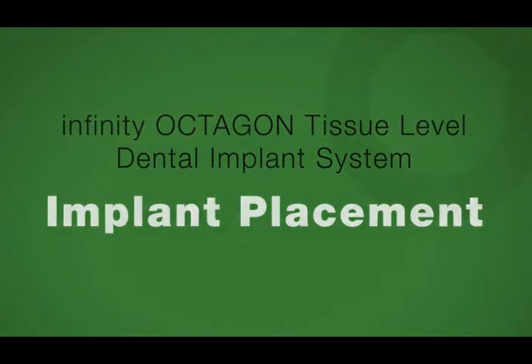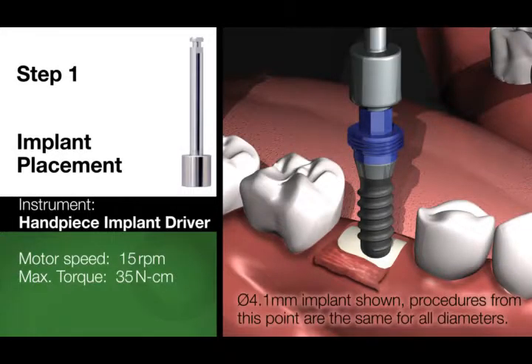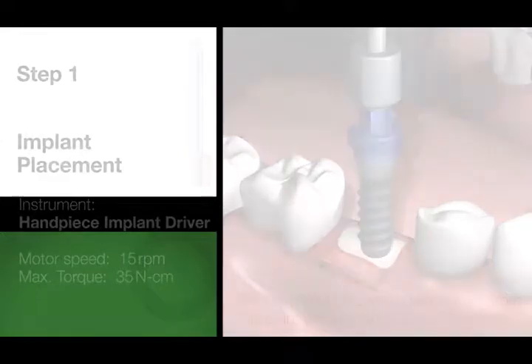Placing the Infinity OCTAGON implant into the osteotomy. Step 1. Implant placement. Insert the implant into the osteotomy using a slow motor speed of 15 RPM and a maximum insertion torque of 35 Newton-centimeters.